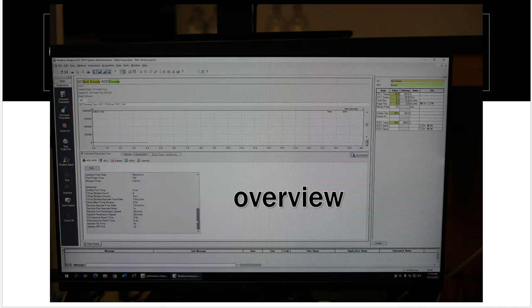And then we try to put big display TV screens in the lab area as well, so that way you can see that a little bit better. That has helped, but at the same time, I think that now you have watched these videos, you've not been distracted. I hope you kind of watched each step along the way and got up close and personal with all of the software issues that we have to go through here.